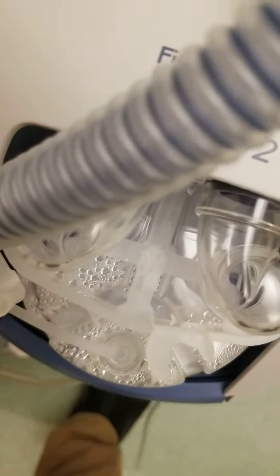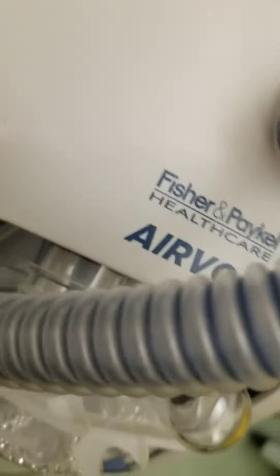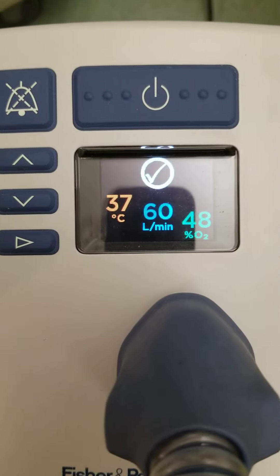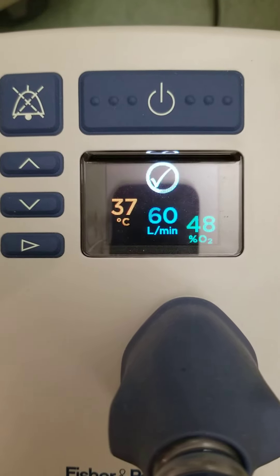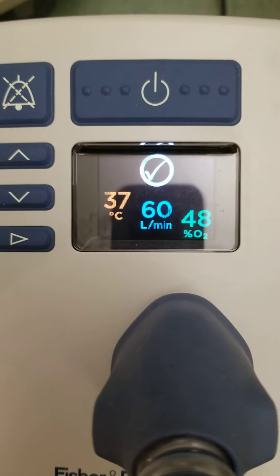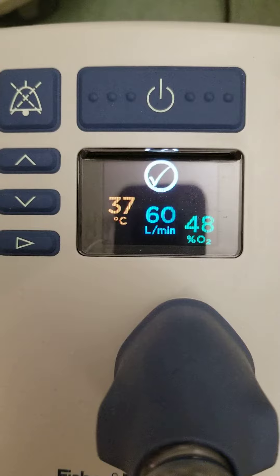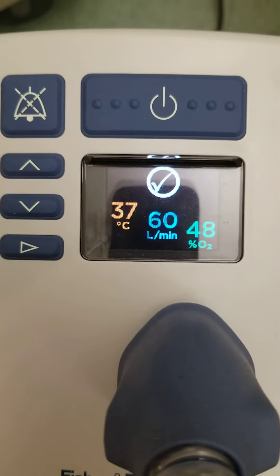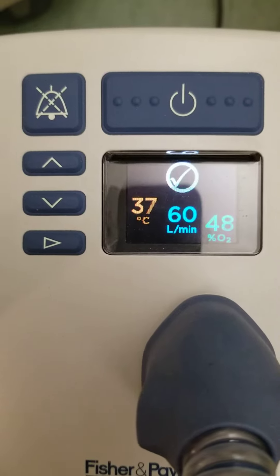What then happens if I connect two oxygen concentrators? As you can see, we can go up to 48% FiO2, so quite significant.